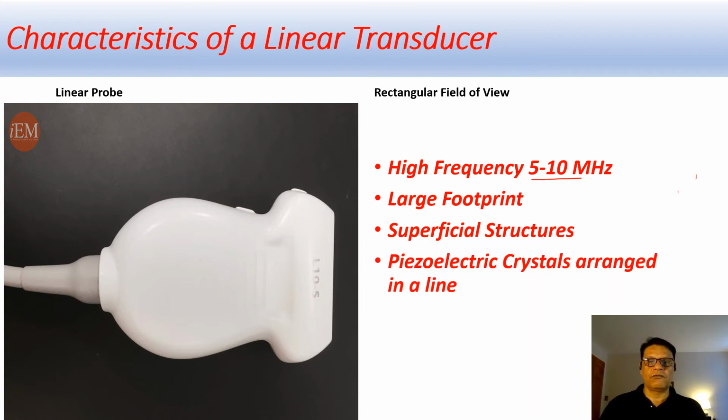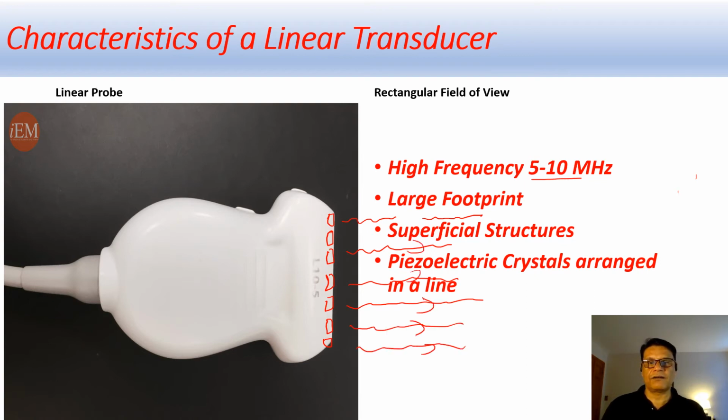And we already discussed that in these transducers, piezoelectric crystals are arranged in the form of a line, and ultrasound pulses are produced from different crystals, and they move in the same direction, and they make a rectangular image.